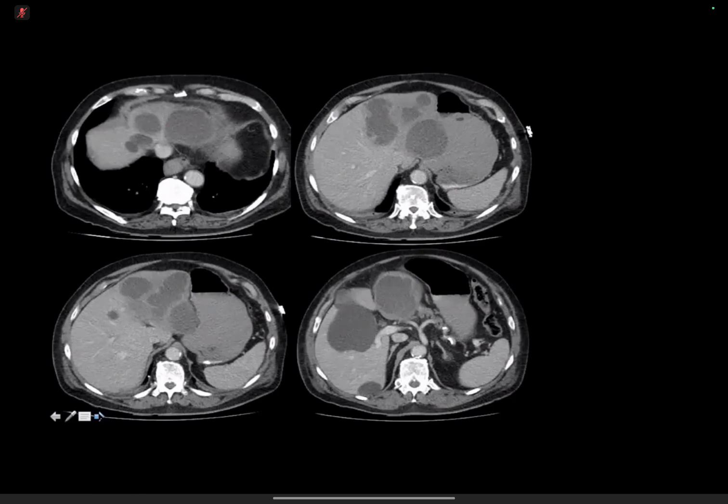In the liver, most predominantly affecting the left lobe, there are multiple discrete low attenuation areas, which I would measure if I had the study in a PACS system, as well as a further large lesion, which is inferior to the liver in the region of the gastrohepatic ligament.